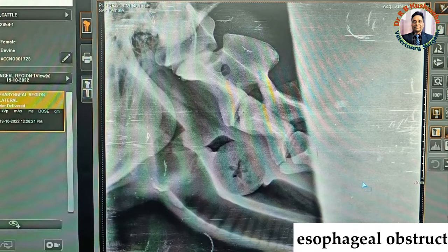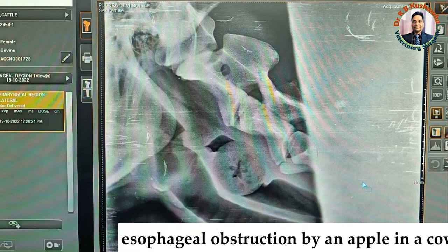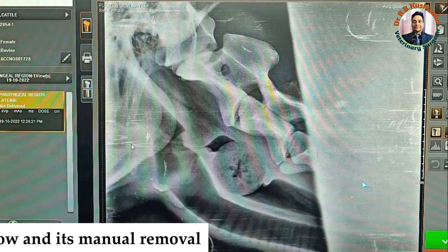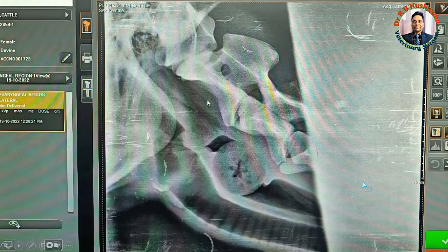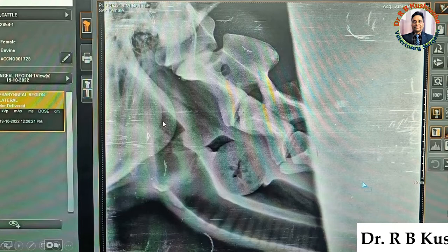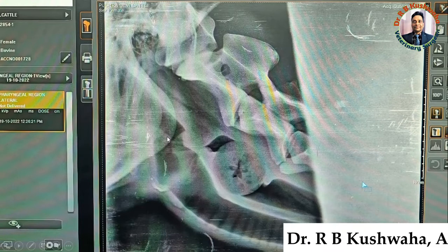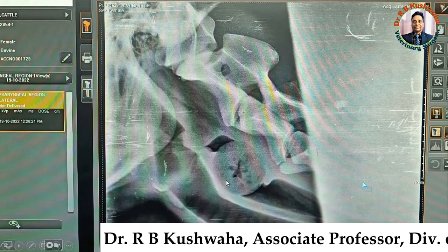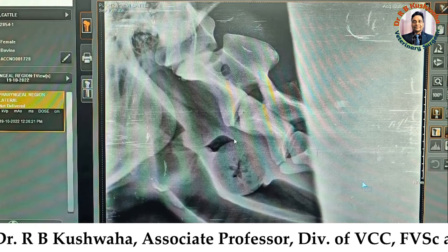Today we are going to discuss about the esophageal obstruction by an apple in a cow. You could see this is a lateral radiograph of the neck region. As far as the geographic anatomy of this particular view is concerned, this is the angle of the mandible, this one is the trachea — the tracheal rings are also visible — and this is the epiglottis.